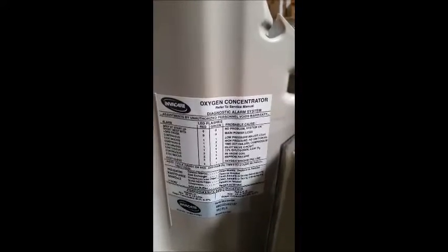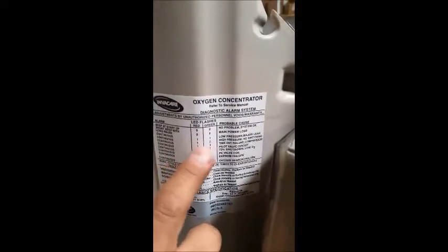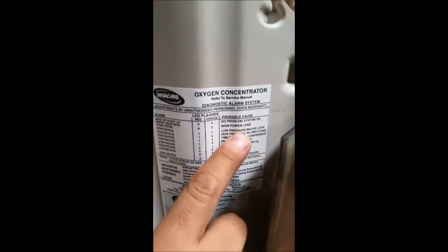Just to confirm what that code is, here's your concentrator manual on the side. It says one green, one red — and that means it's a low-pressure major leak.